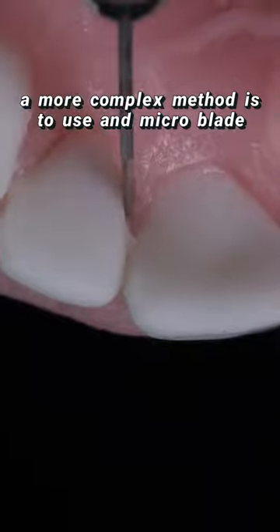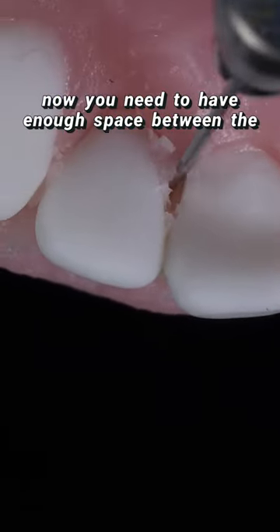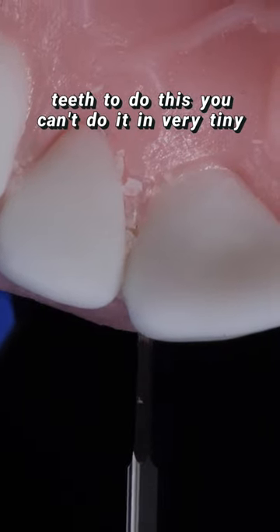A more complex method is to use a micro blade and then do a palatal incision. You need to have enough space between the teeth to do this — you can't do it in very tiny papillae.